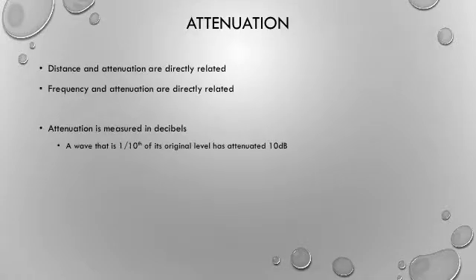So the attenuation coefficient is just a way of describing how much loss there is overall, depending on the frequency and how far you're going. That's all it is. So if we're imaging at 6 centimeters deep, you lose some decibels every centimeter. You hit a reflector and you lose decibels coming back, right? So if you're imaging 6 centimeters deep, the sound is traveling 12 centimeters, and so we've lost sound all the way through that. So energy is just absorbed every centimeter, okay?